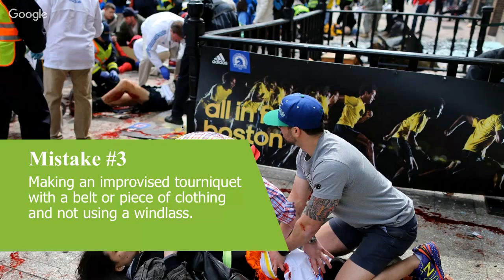Take anything away from those first responders and bystanders at the Boston Marathon bombing, because that would have no doubt been a horrendous situation with minimal equipment there. But there's a paper that was done soon after, in 2015, that showed there were 27 tourniquets applied, and all of those were improvised. None of those were commercial tourniquets. There was, I believe, a journalist's photograph of a CAT tourniquet in situ, but there's no documentation on who applied it or where it came from.